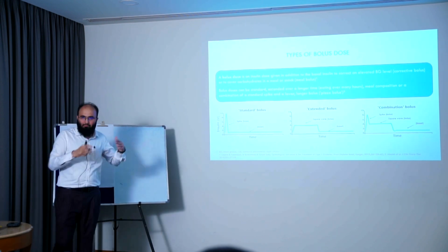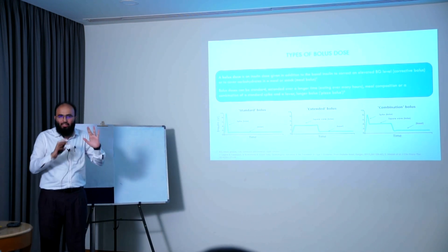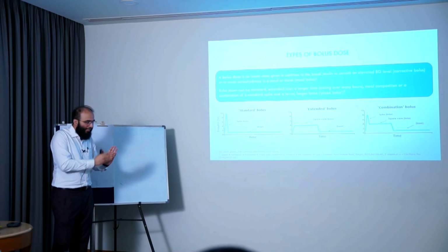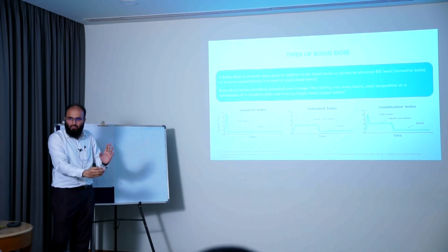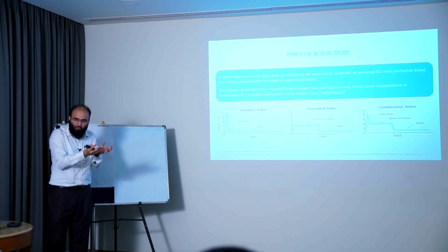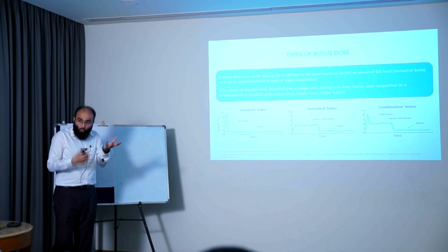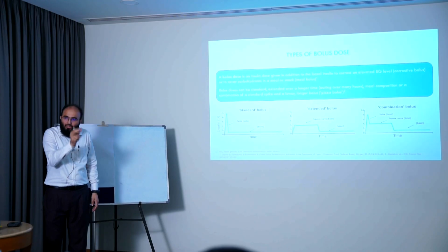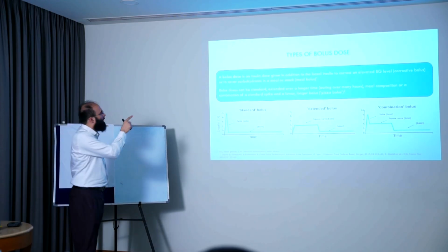So basal is what is ongoing so that hepatic glucose output and interprandial sugars are maintained. Bolus is, after eating food, the sugar is going to rise, and to control that you need to deliver insulin, that is bolus. Or you have given the bolus, yet his sugar is high. So that correction dose that you give is also a bolus. That is what this statement says.